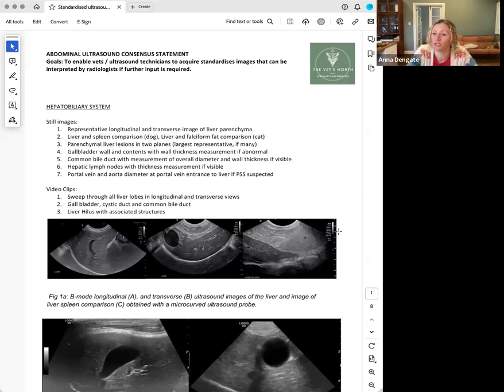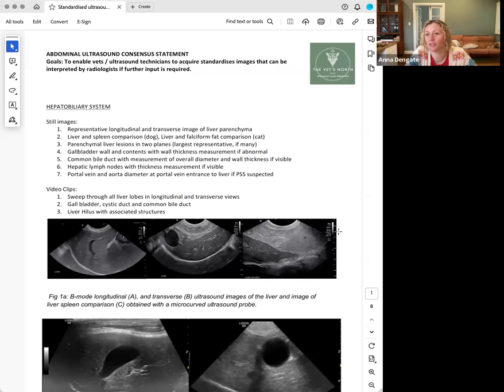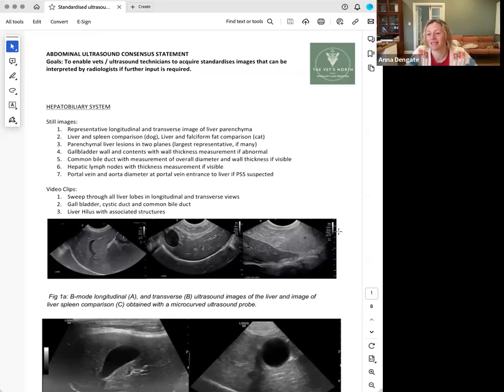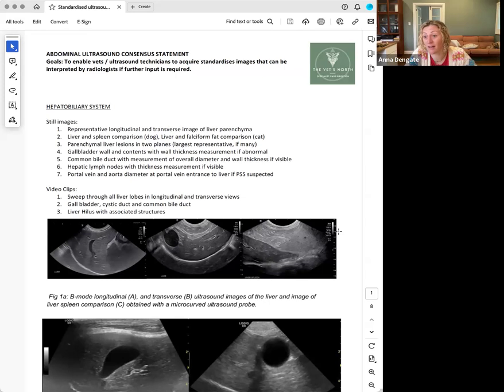And what marker would you look for? Rounded margination. Yes, yeah. And how would you differentiate a congested liver from an infiltrated liver? Large hepatic veins. Yes. Good. Excellent. So hepatic veins and a cava. Do we have normal ranges for those? One-to-one with the aorta. Yes, good. So that's a really nice thing to be able to do. The cava shouldn't be more than the diameter of the aorta.